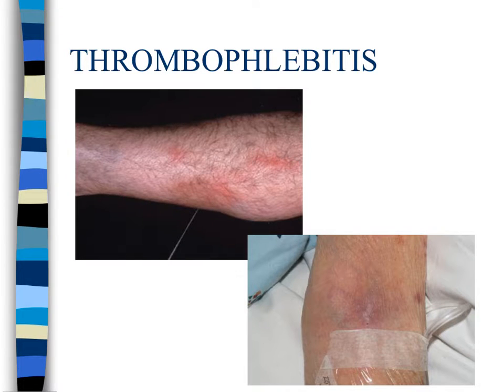Nursing management includes removing the entire IV catheter and restarting the infusion in the opposite extremity using all new equipment, consulting the physician, and providing comfort by applying a warm, moist compress to the area for 20 minutes. Documentation includes all observable symptoms and the patient's subjective complaints, such as feels tender to touch and it hurts. State your actions to resolve the problem and the time at which you notified the physician. Document the site in which you restarted the infusion.